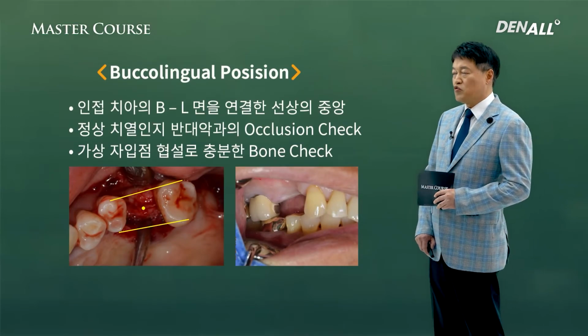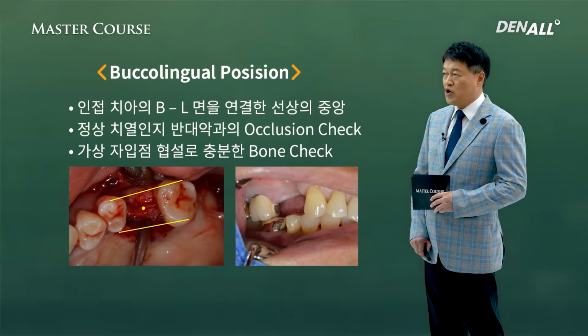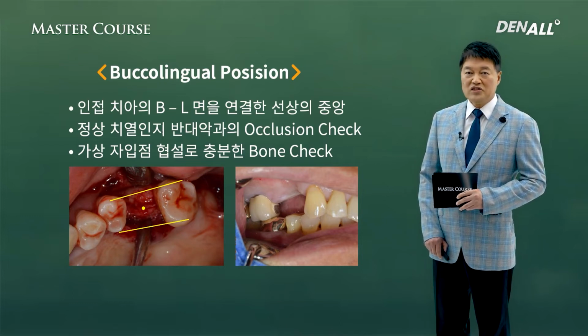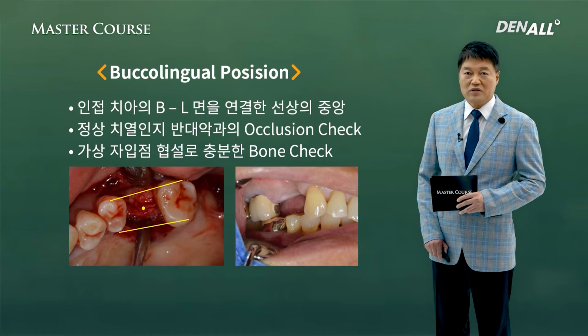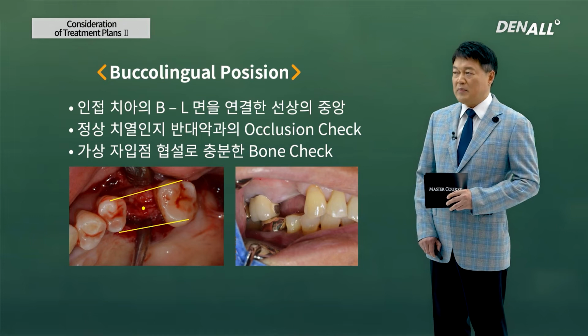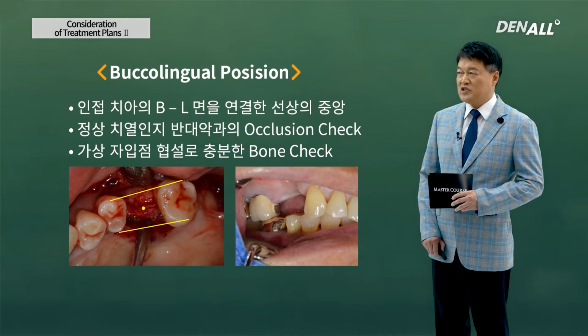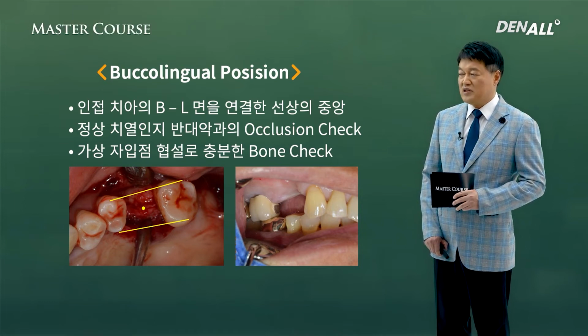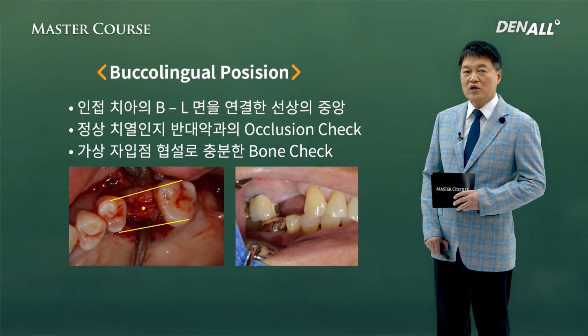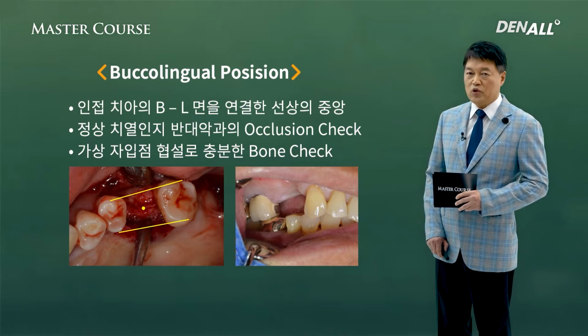The next is buccolingual position. If you try to get buccolingual position, it should align with the buccolingual center of adjacent teeth. And check whether this is normal dentition and also the occlusion with the opposing arch. Check whether there is sufficient bone in the imaginary entry point, and after we place it buccolingually, check if there is over 1 millimeter of bone on both sides.